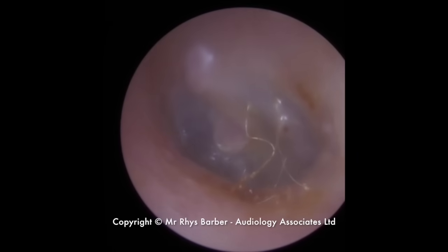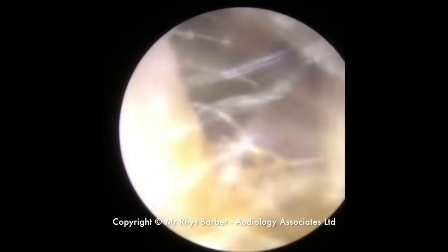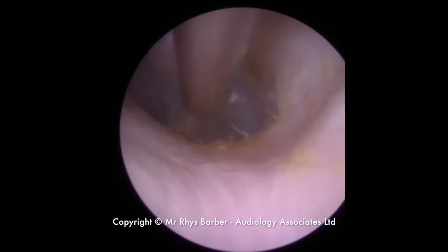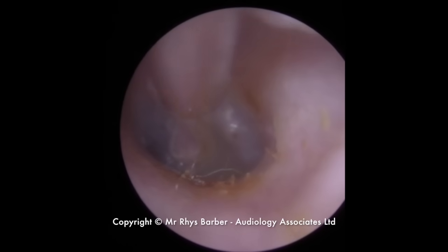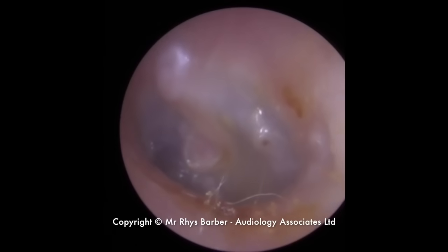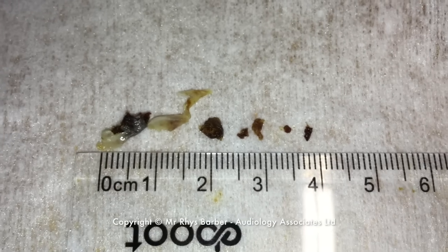Now you can see there are some fine hairs in here. I get asked this question: why don't we remove these fine hairs? Look what happens when you put the suction on them — that's all they do, just flap around the end of the suction, but they don't actually go anywhere. You might get the odd one that gets sucked in. You can see the eardrum there. These will get washed away with the next bath or shower.